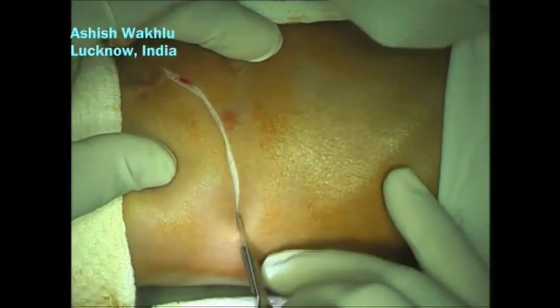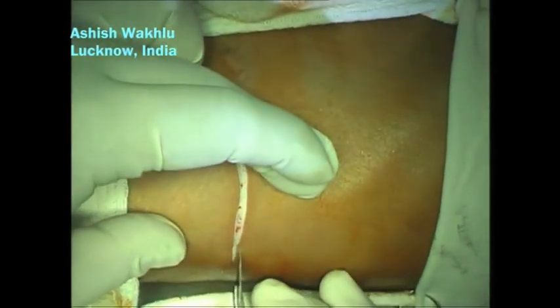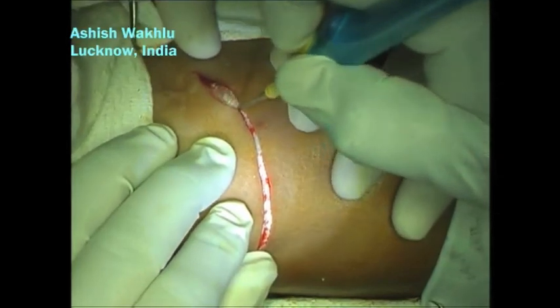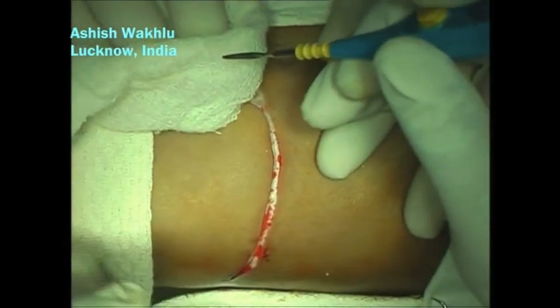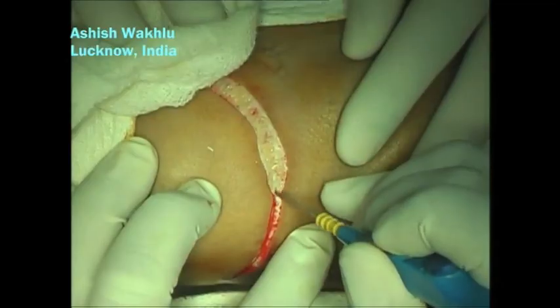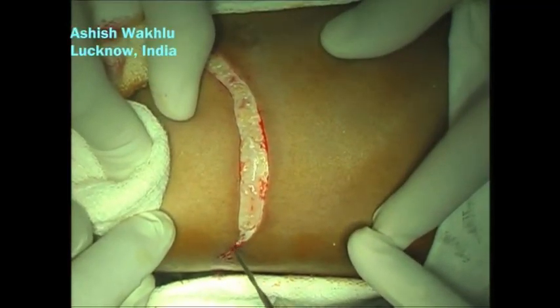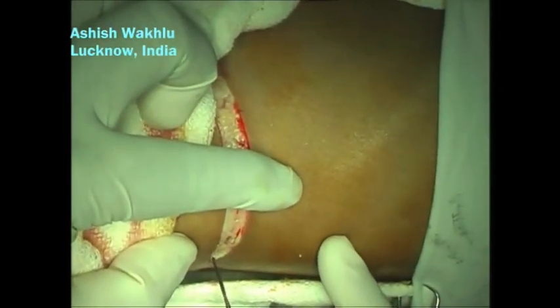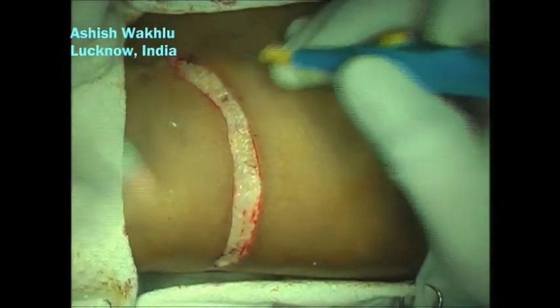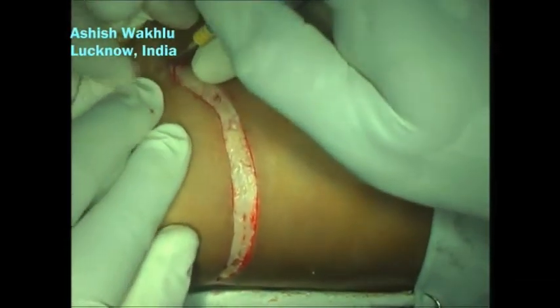The skin was divided in the line of incision a little below the inferior angle of the scapula, and the subcutaneous tissue and muscles divided in the same line to access the ribs and intercostal spaces. The subcutaneous tissue is now divided in the line of incision.